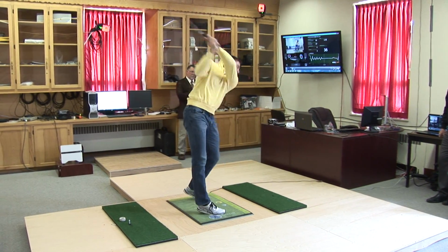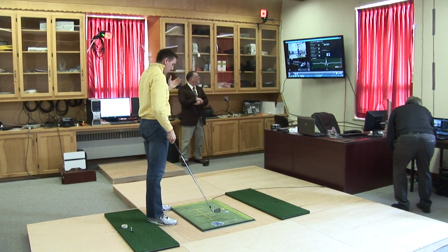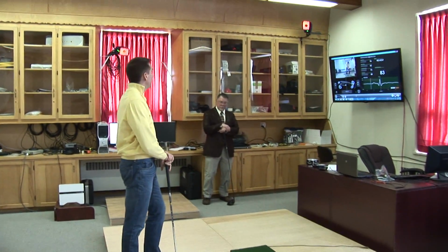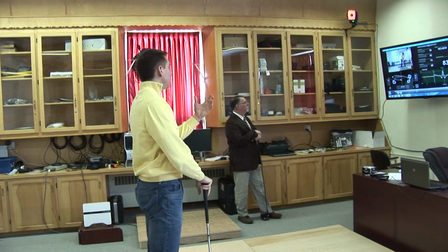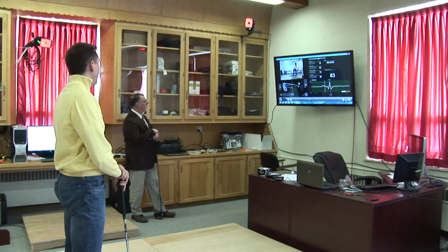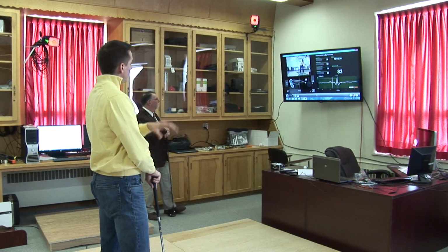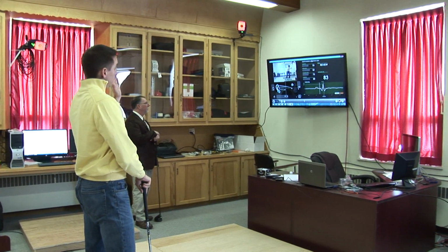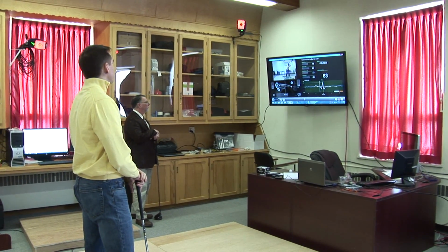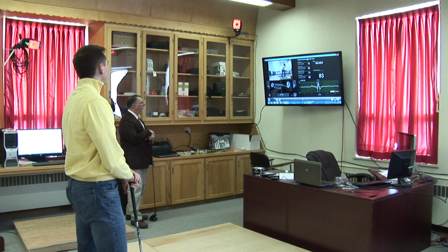Now, I'm not the greatest golfer in the world, but there are lots of golfers much better than me who would have a somewhat similar center of pressure trace pattern. So, at address, not too bad, about 50-50, and then I move to my back foot, and then I'm definitely a bit of a jumper, so I get the weight out towards my toes. We're not going to particularly look at that one, but initially on the downswing, my center of pressure is going to start to shift towards my front foot. And I'll get Terry to advance it right to the furthest point, one more frame, right there.